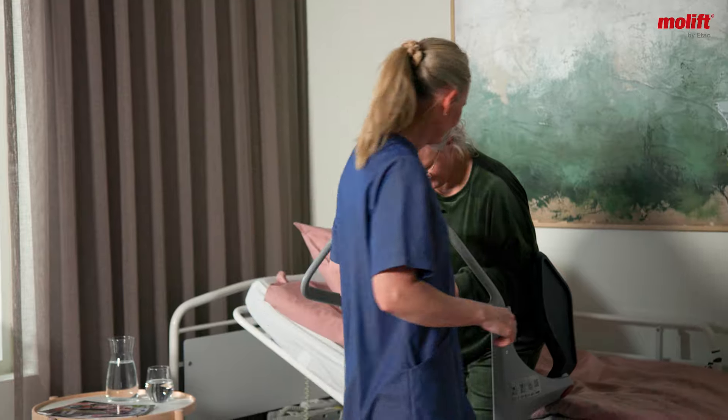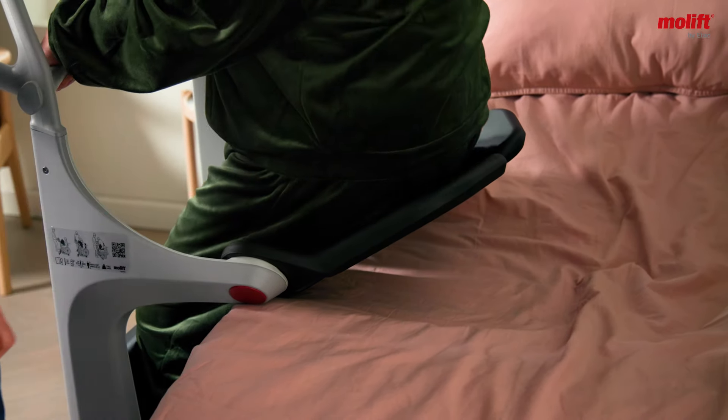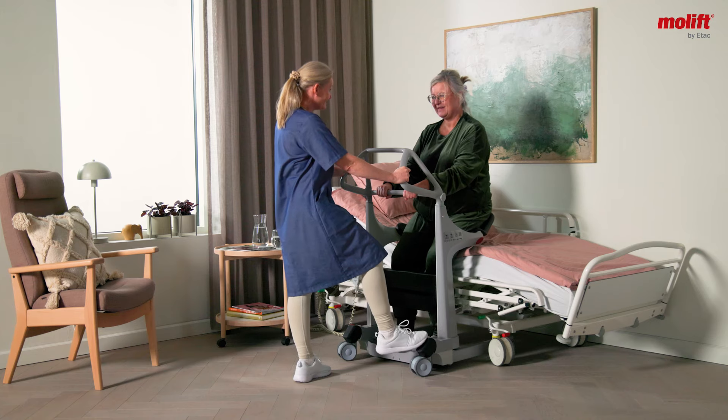MoLift Transfer Pro is a sit-to-stand device for seated transfers, making day-to-day routines less challenging and reducing the physical burden on caregivers.